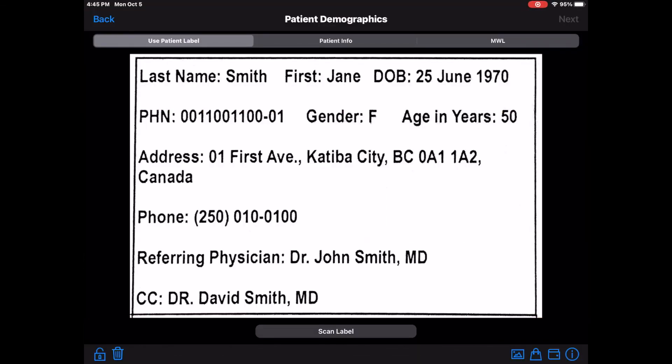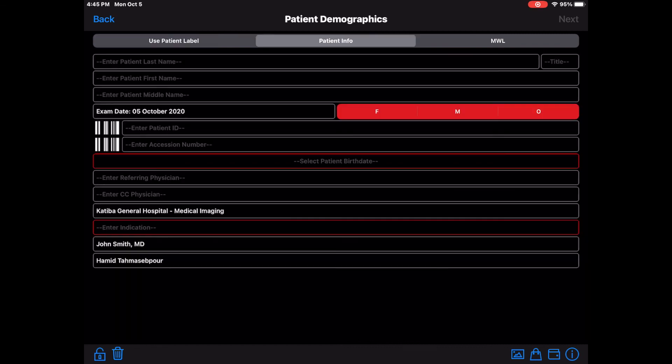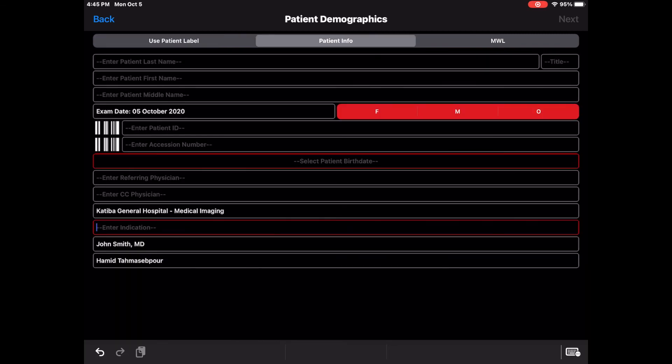If you would like to add the patient history or indication to the worksheet or report, go back to Patient Info and enter it manually.